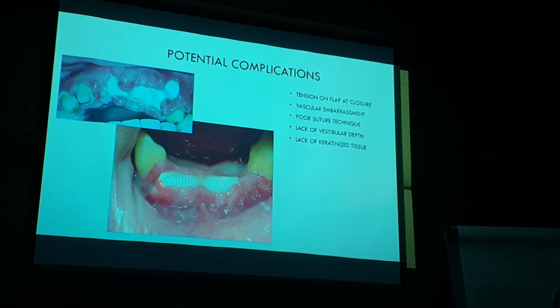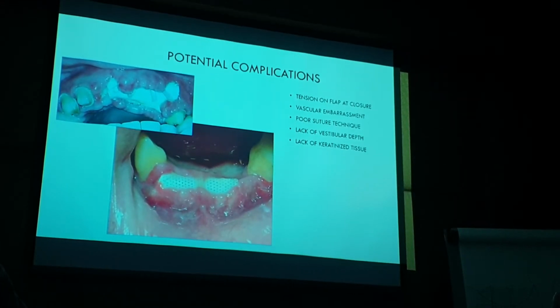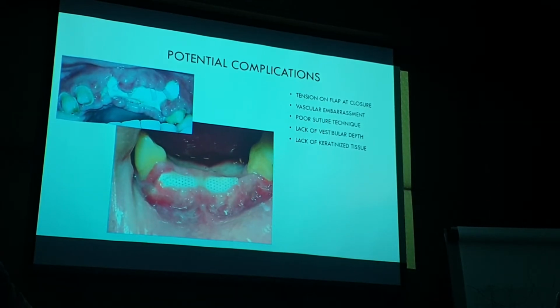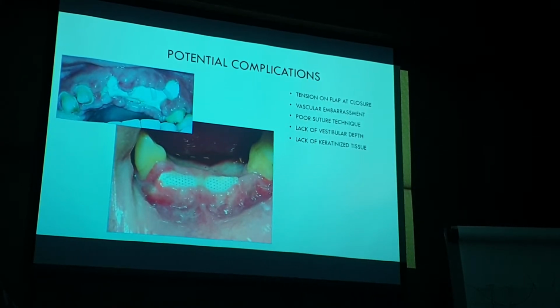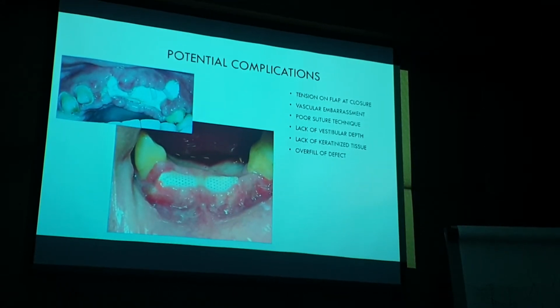And I'm going to show you some videos, I believe, today, that show what happens when you pull on a cheek or a lip with narrow vestibular depth, and you can see the whole mucogingival junction and the free gingival margin moving, even though there's 3 millimeters of keratinized tissue. It's meaningless unless it's attached to bone. Another reason why we develop periimplantitis. So maybe we have keratinized tissue without attaching to the bone? How can... Oh yeah, I'll show you that. Very simple. Very simple. You see it all the time.